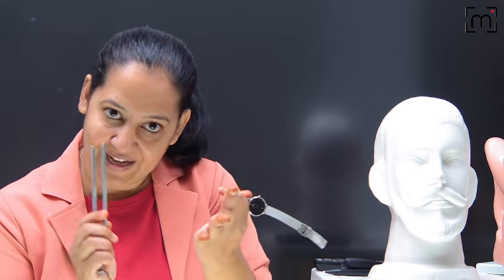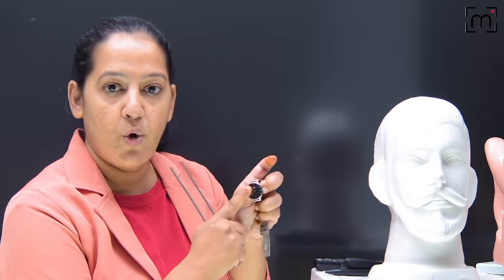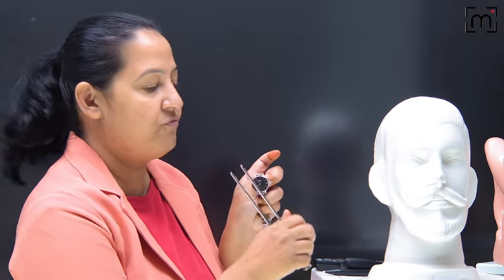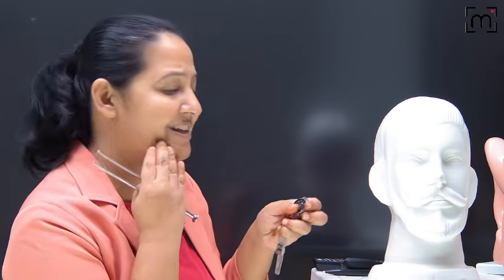Then again I will activate the tuning fork and keep it on my own mastoid. I am the examiner. Again I will start the stopwatch and see for how many seconds I am hearing the vibration, and I will compare the seconds in the stopwatch, the patient's duration of BC and my duration of BC. So first I will activate it, keep it on the patient's mastoid and note it here, and then I will activate it, keep it on my own mastoid and note the seconds here. You got my point? This is another, better way. You can note down how many seconds.